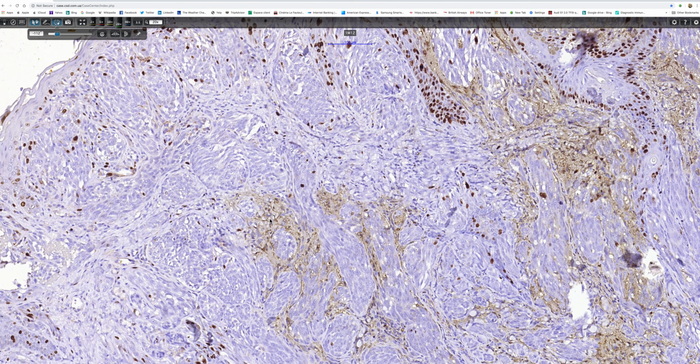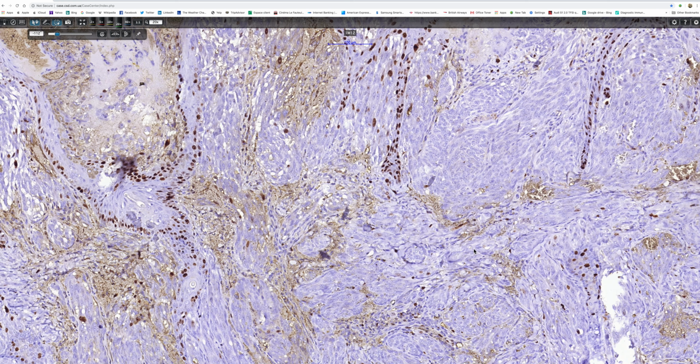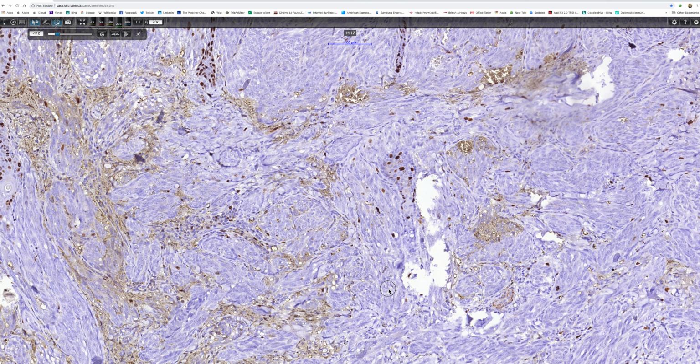should worry us. If we did a cyclin D1, that would also be useful, and we didn't, but I'm assuming if we had done it would have been negative. But that's as good a negative Ki-67 as you're likely to see.